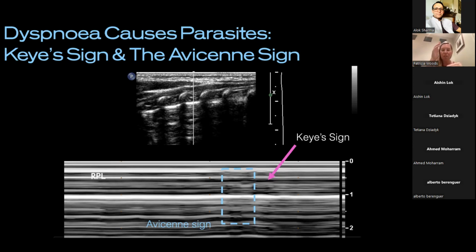But it's important, does it change in nature and quality as you cross that pleural line? Because if it's a mirror image of that above, highly suggestive of air leak, you can't diagnose behind air. Okay, if it changes in quality and pattern because of contact and movement, it can really help you define. And when you do this in reality, when you press your M mode and it's sampling it, you often get a really nice grainy, soft gray 2D picture that you can actually see the contrast of pleural sliding a little clearer sometimes. So that alone can help answer that question: is there presence or absence of pleural sliding?